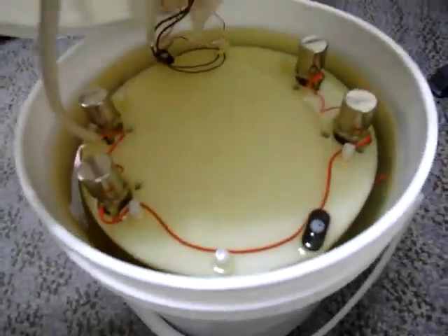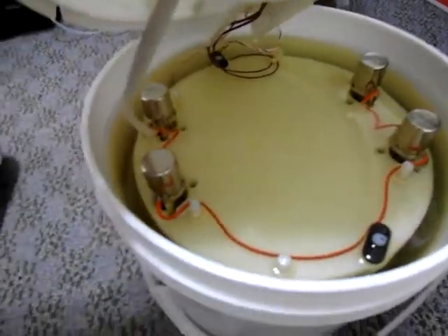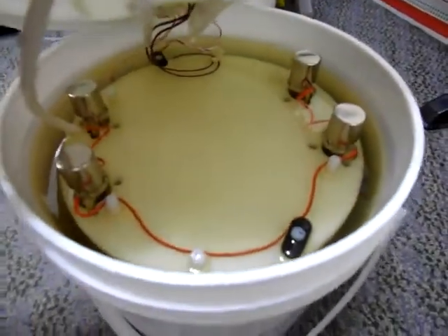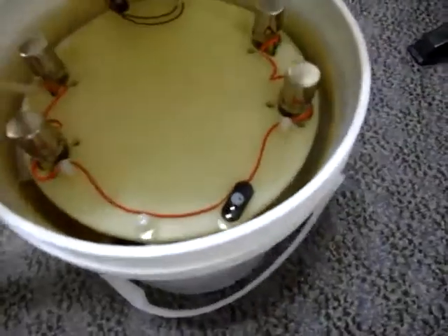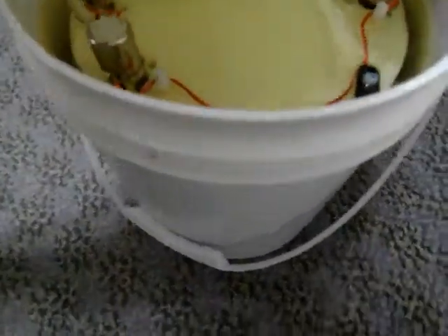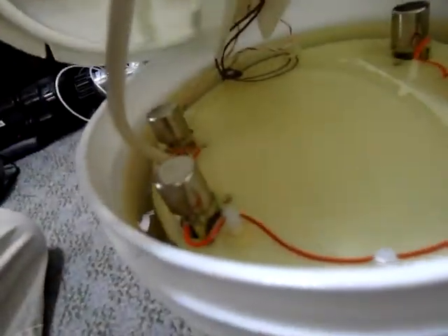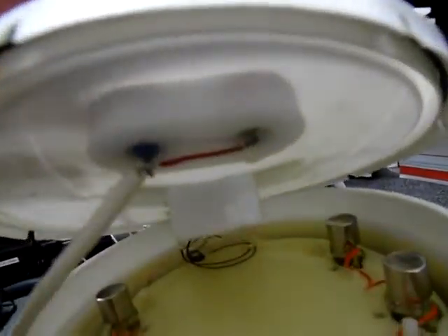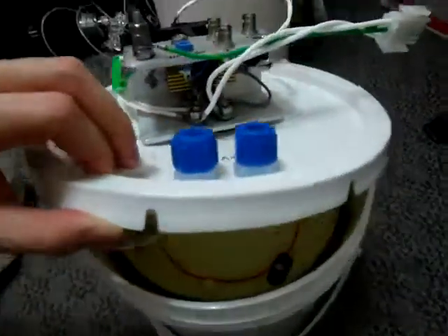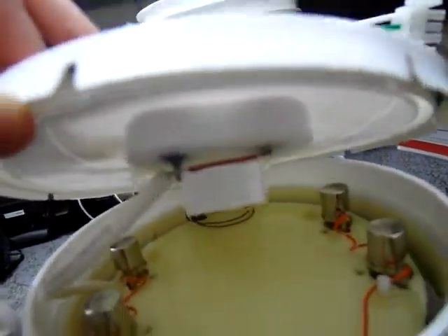Since each diode string is only conducting half the time, the maximum output that the diodes can withstand is approximately 30 mA. The transformer is immersed in the oil for insulation and cooling, which insulates both the primary, secondary, and the diodes. The output line from the high voltage rectifier goes through the feedthrough to the top of the bucket through two output connectors, and they are tied together electrically internally.